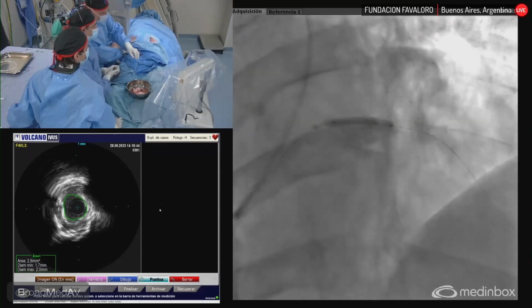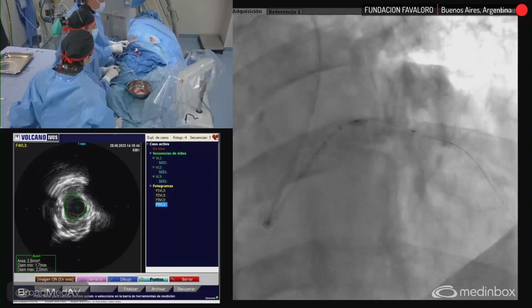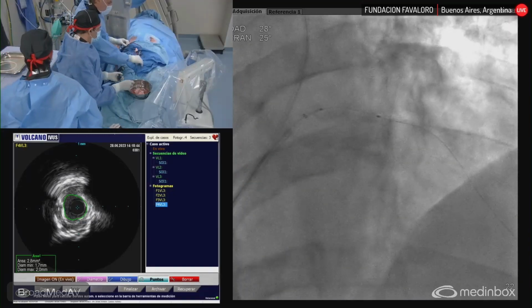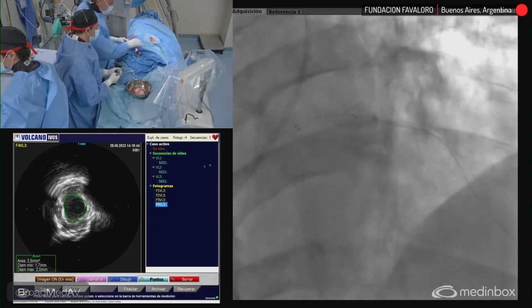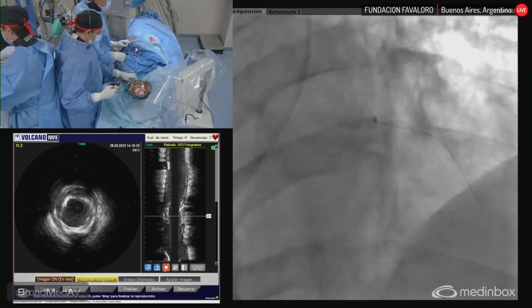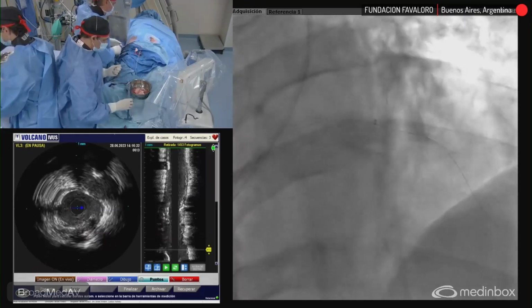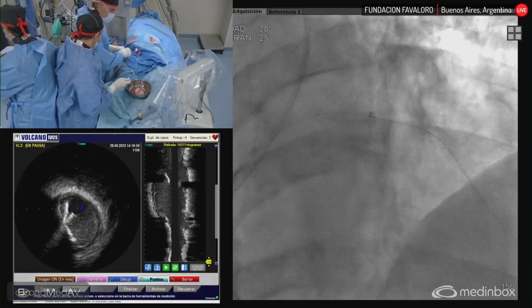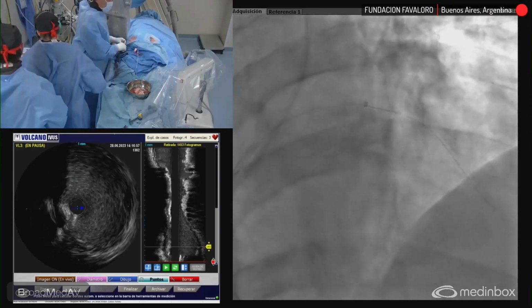Okay, so we can inflate there. We have the tight calcification, a 3.0 cutting balloon. Do you have the 3.0? Okay, so let's leave the balloon there. I'm gonna advance the telescope device, because the profile of the cutting balloon is absolutely worse than these balloons. So keep this 2.5 high pressure balloon there. Give me the cutting.